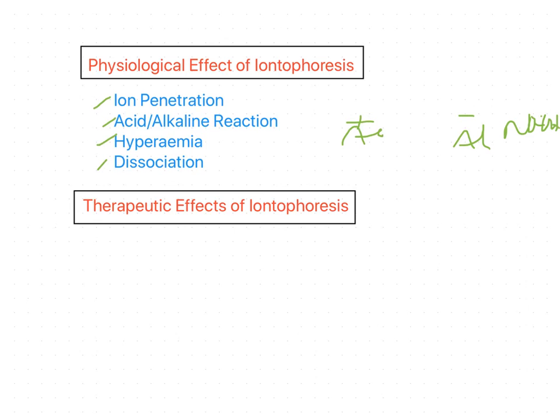The anode is sclerotic, making tense, hardened tissue and serving as an analgesic, possibly due to the local release of oxygen aiding in the vitality of the tissues.